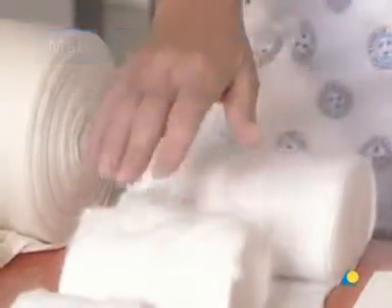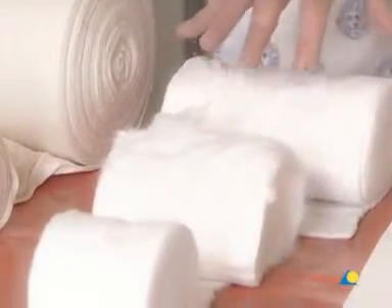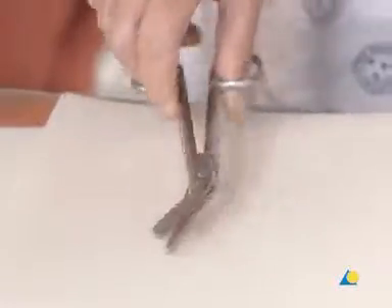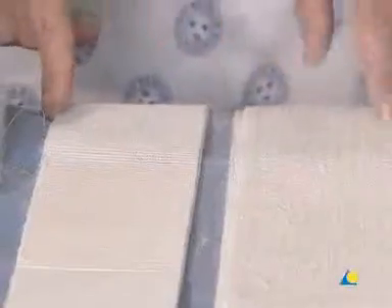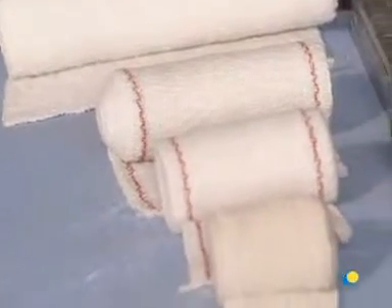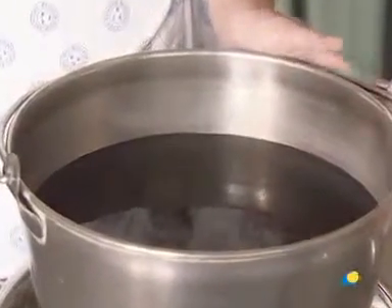To apply the extension block splint, the following materials are needed: cotton wool, used for undercast padding; surgical tape, which is used for buddy splinting; scissors; plaster slabs that are generally five layers thick and available in differing widths; a crepe bandage to secure the plaster slabs; and water, or another wetting agent.